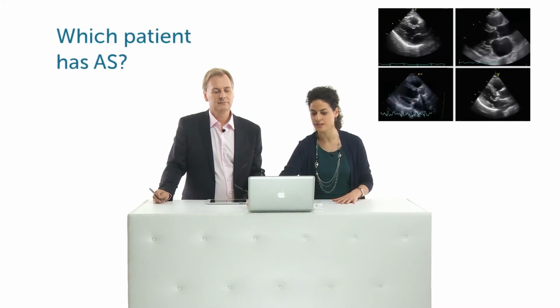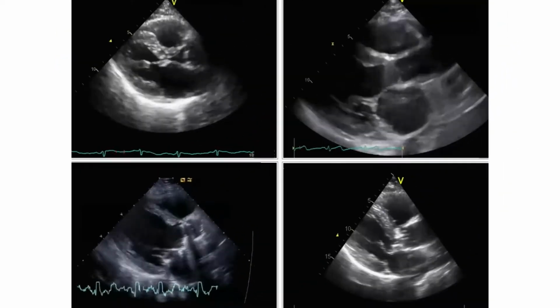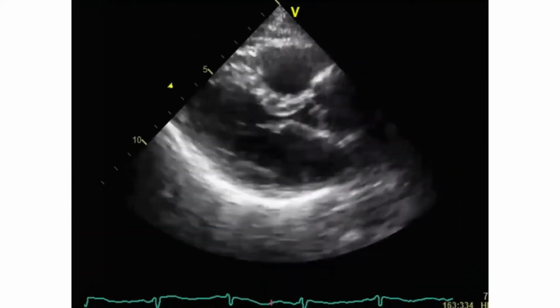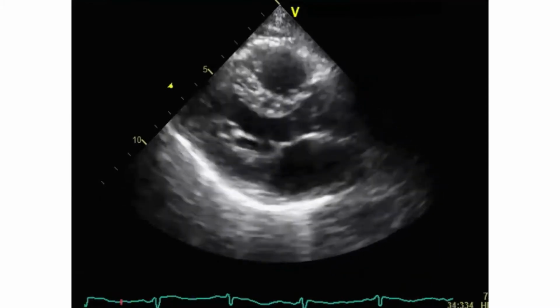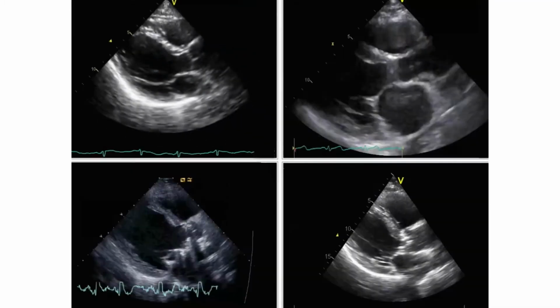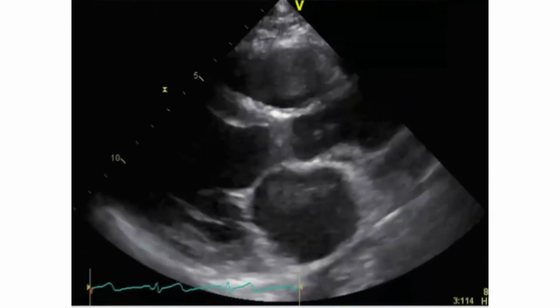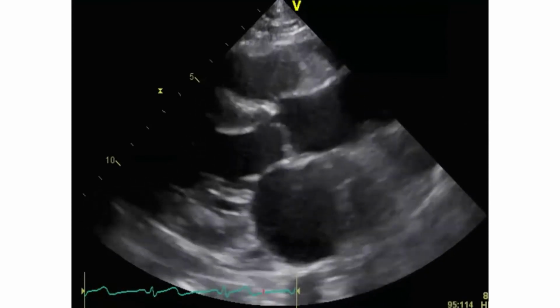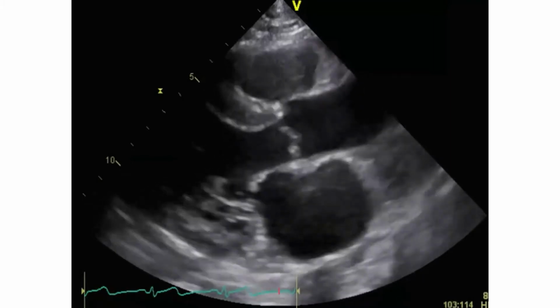We selected four loops with the aortic valve. Remembering what we've told you, considering the factors that you've learned, guess which one has aortic valve stenosis. I will show you the first loop in detail. So consider the thickness of the cusps, calcification. Do you think this is the one with aortic stenosis? It's maybe the second one. Focus on the aortic valve, opening and closure. Make your choice. I'll give you the third example.